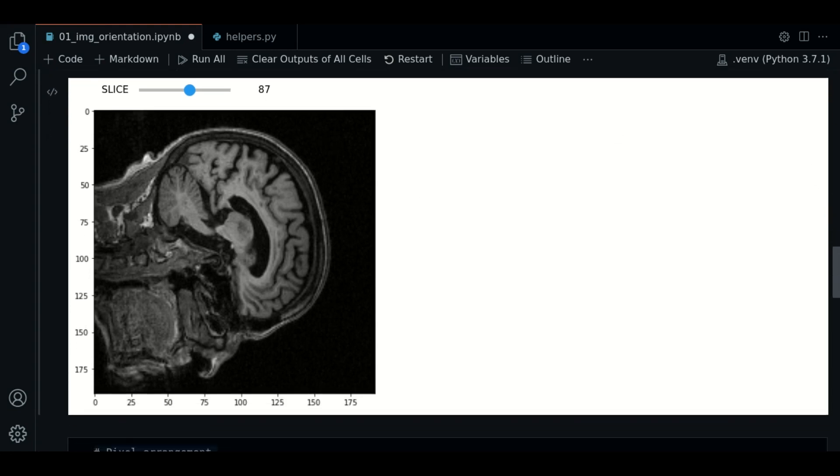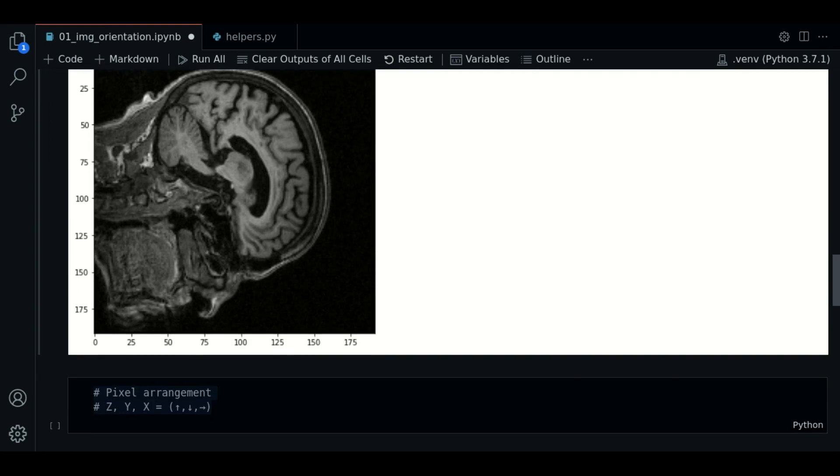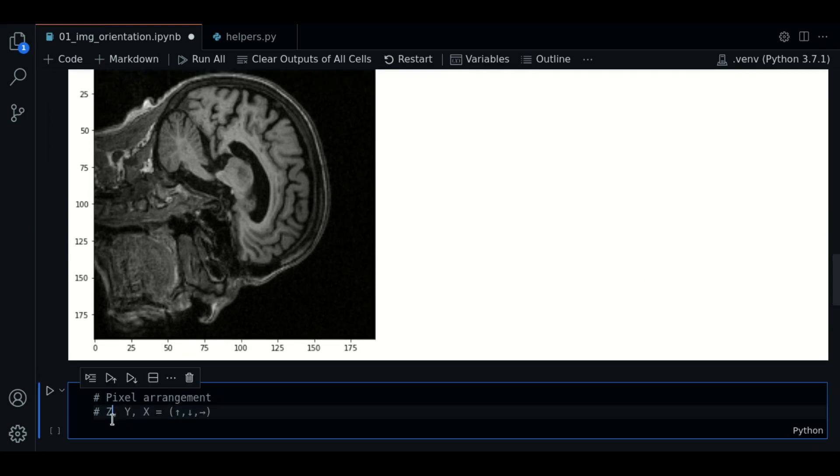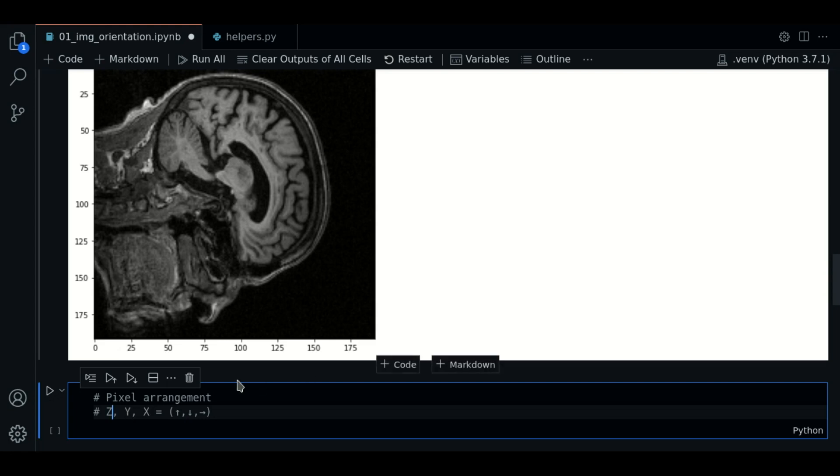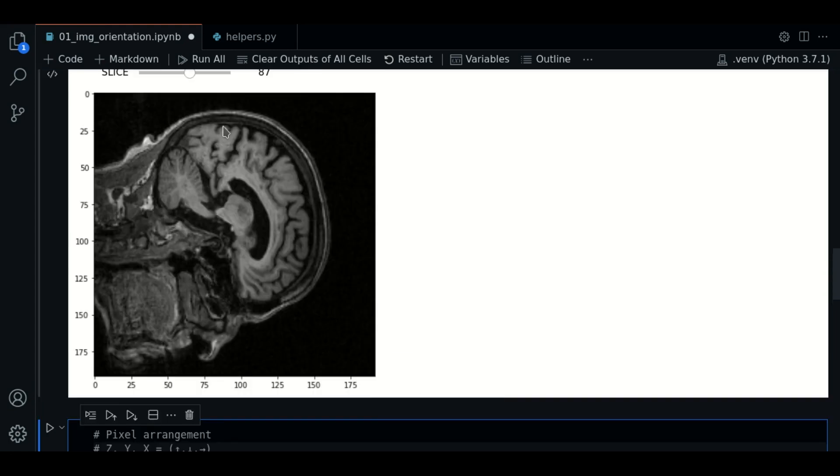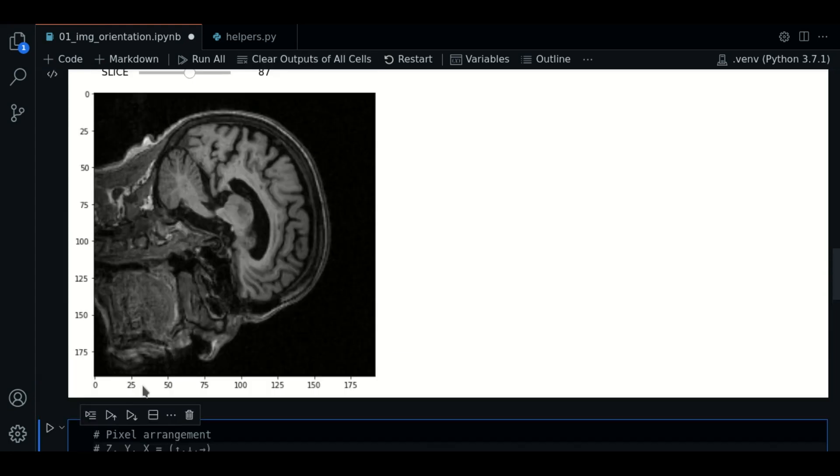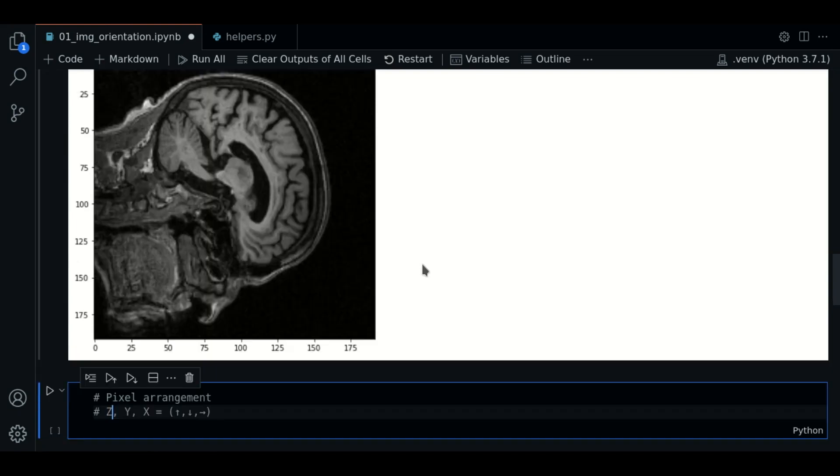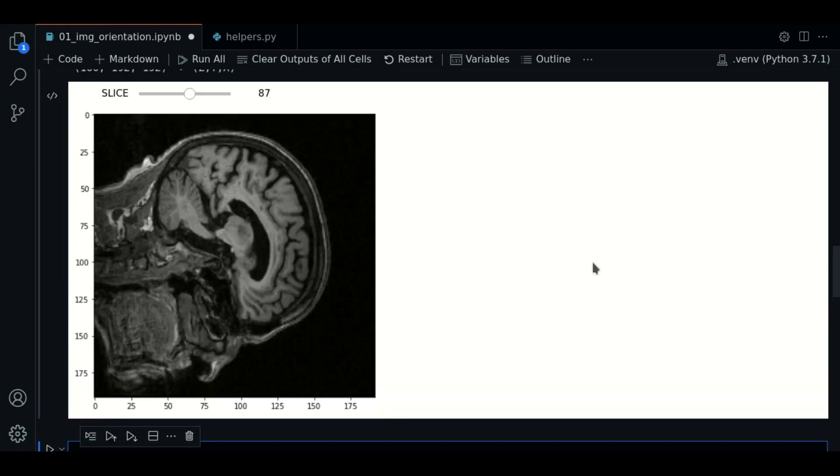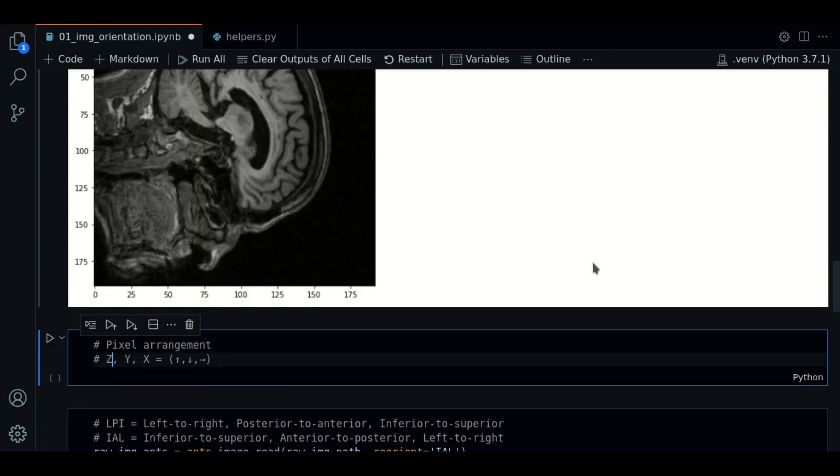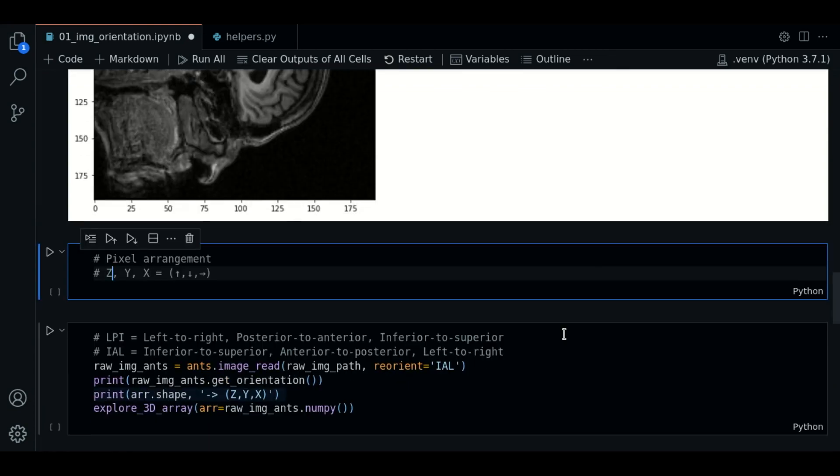Let's make a recap. The first dimension corresponds to the slices we go along. The second dimension corresponds from top to bottom in the two-dimensional plot. And finally, the third dimension corresponds from left to right in the two-dimensional plot. But this is so because the orientation string is LPI. What about if we want a different orientation?